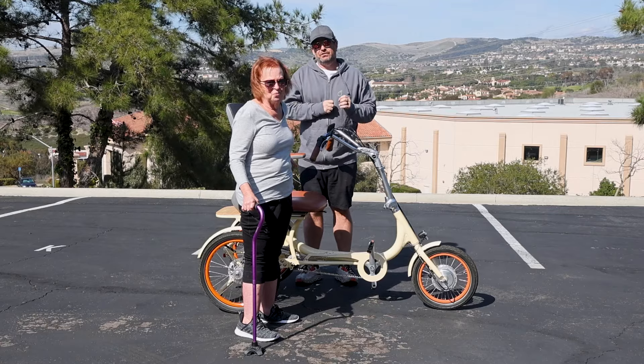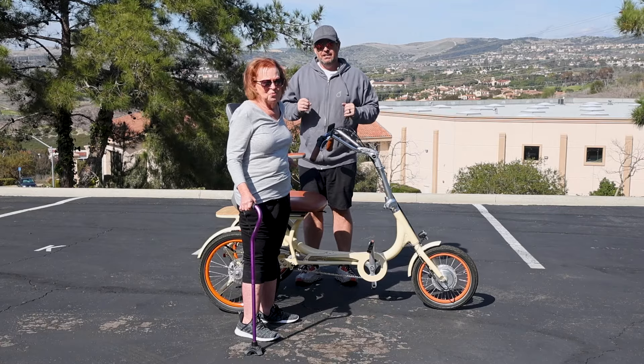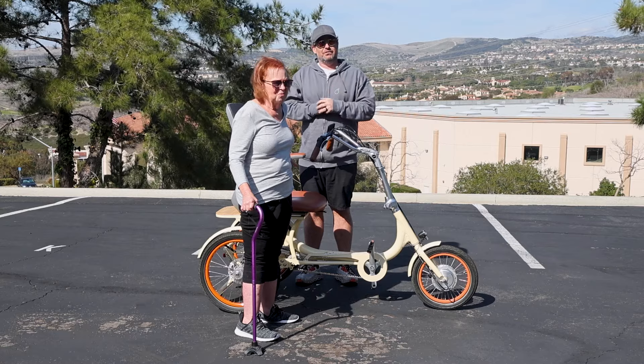A mobility electric tricycle that can double as a scooter if you have physical limitations. Stick around to see it.